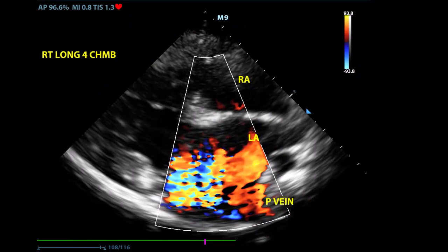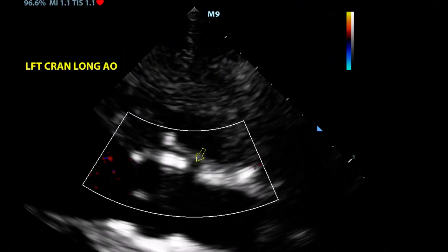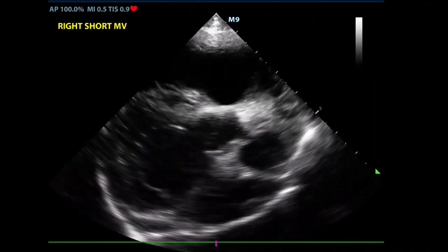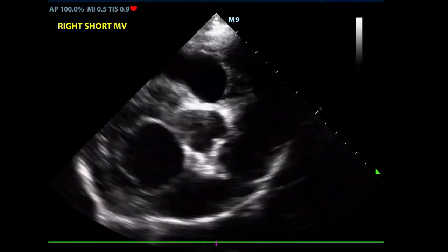My general cardiac exam educational videos show you how to obtain standard cardiac ultrasound views and how to make standard measurements. The purpose of this series of video blogs is to help the beginner recognize cardiac anatomy as displayed on the ultrasound screen and to interpret a likely meaning for what is seen.